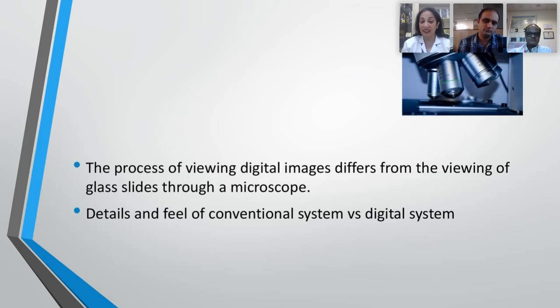And clinical decision, currently we are taking it manually, but we have every slide go to DM12 now, which is getting incorporated in our slide review criteria. So there is a deviation and the workflow is fast. Although we need a dedicated person now, a technologist or a pathologist who gets into reviewing the slide on the screen, where, as sir also mentioned, Dr. Srinivas, there is a beautiful depiction of all the cells together in one screen and one dashboard.